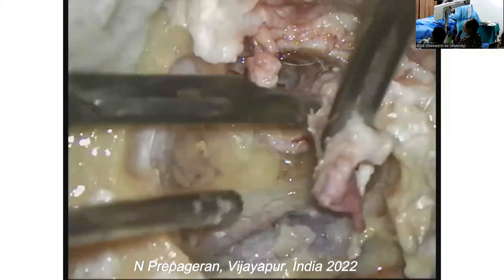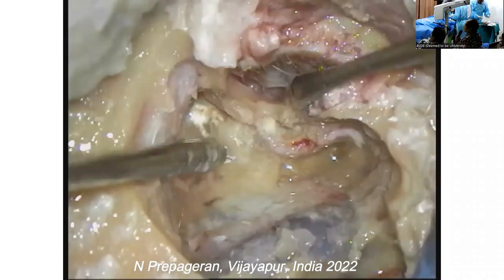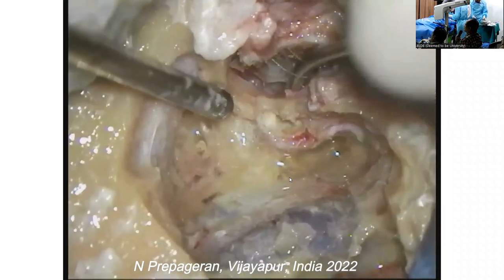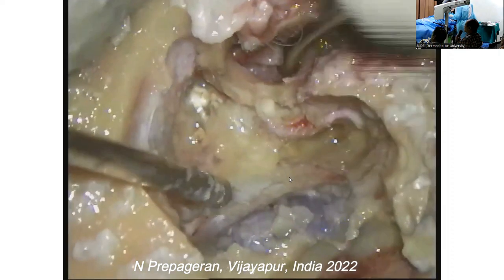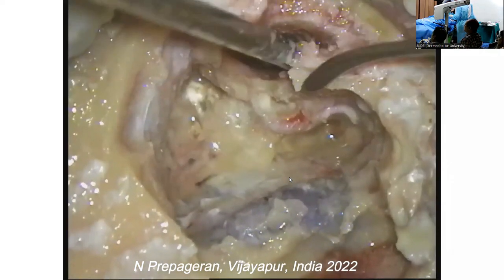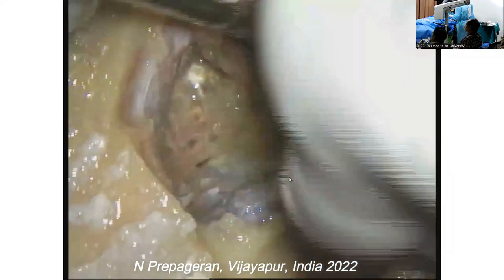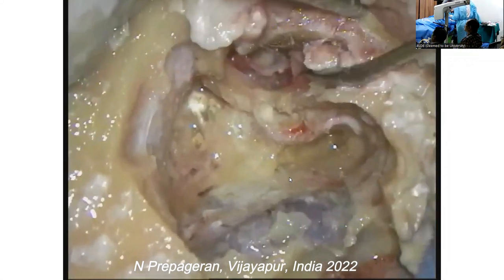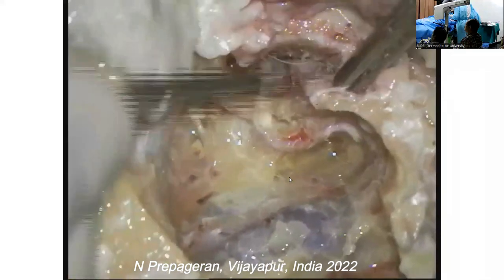And cut. Okay, good. So now we can go into the middle ear space. I wanted to go inside. And this one, we need to remove this as well. Okay, so now you can give me a cutting drill.